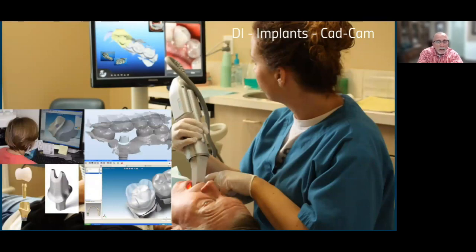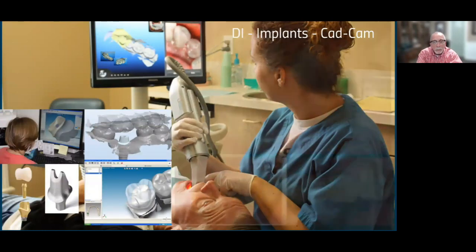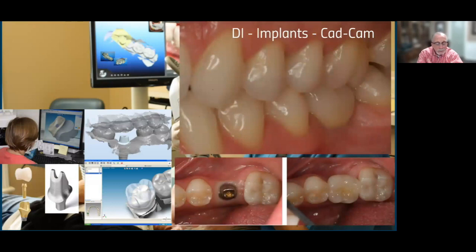And we would take that data and we would have the abutment made, and we would build the crown. And we could deliver this in a pretty quick turnaround, right? Because it was all in one tight digital circle. And to me, that is the preferred ideal workflow for an implant restoration, right?